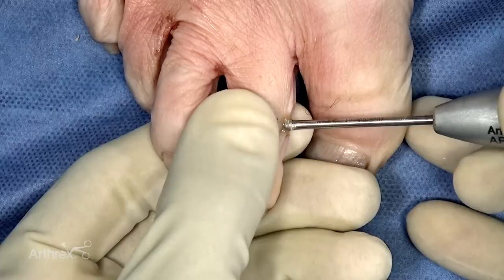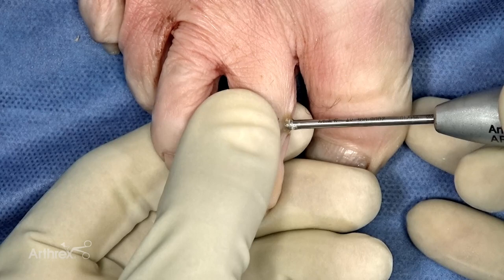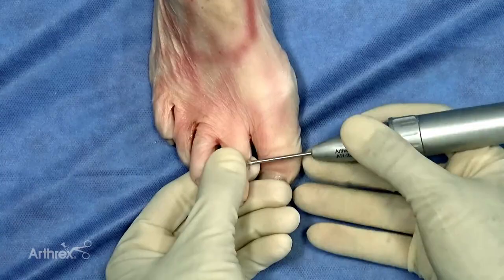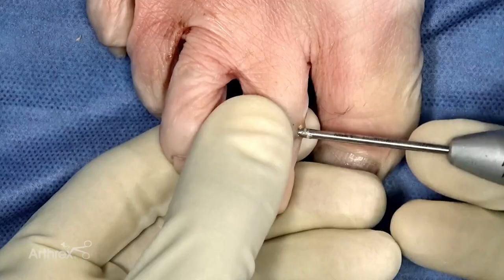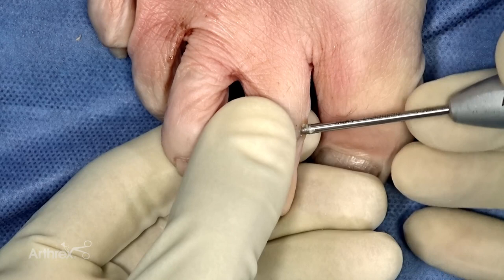Once the burr is in the central aspect of the bone, I utilize controlled plantar and dorsal translation maneuvers to prep the articular surfaces on both ends of the bone. I apply proximal pressure to prep the proximal phalanx and distal pressure to prep the middle phalanx.